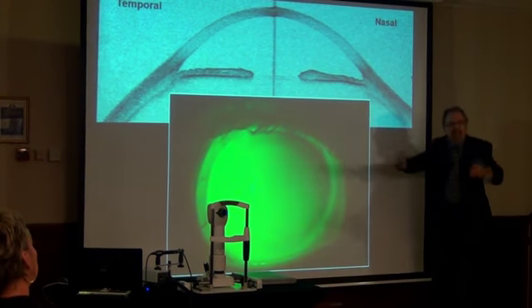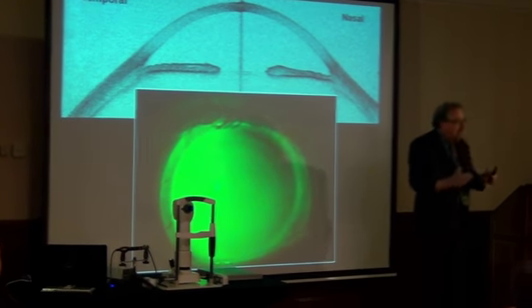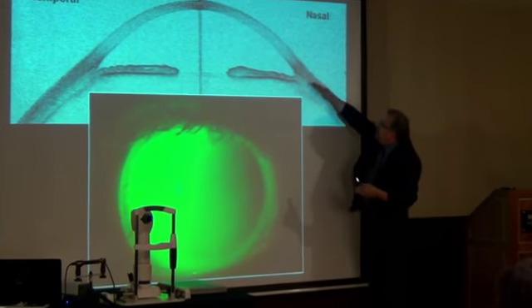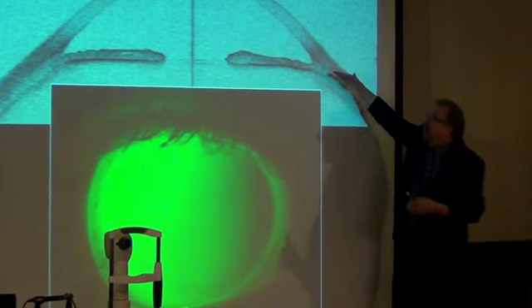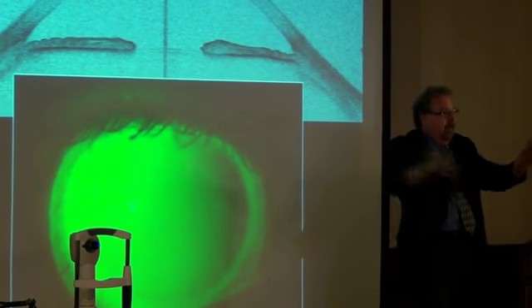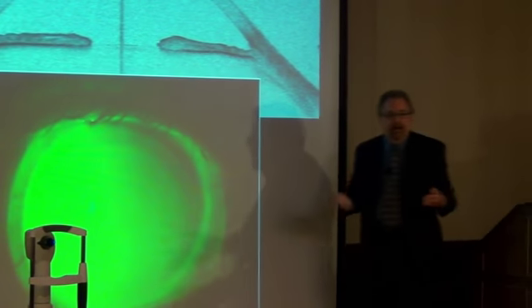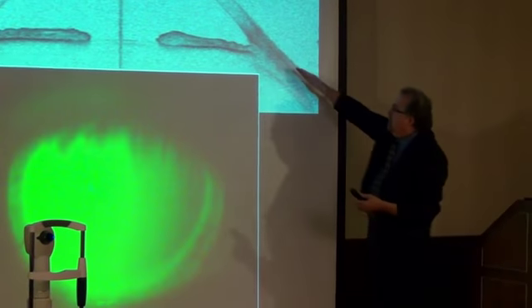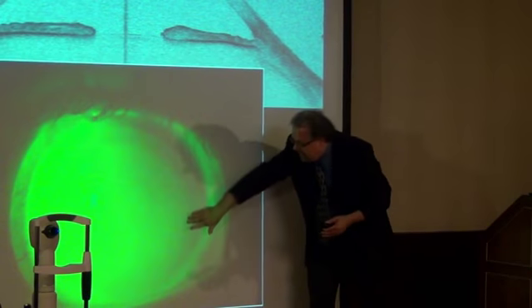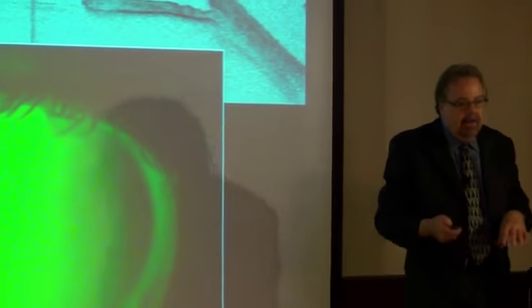It's elevation. Everything we do with contact lenses is elevation, how high or how low. When this is slightly higher on the nasal side than the temporal side, which by the way it is in 100% of humans, it's just the way the extraocular muscles insert that create this slightly elevated area here, we're going to see a little bit of thinning on that nasal side.